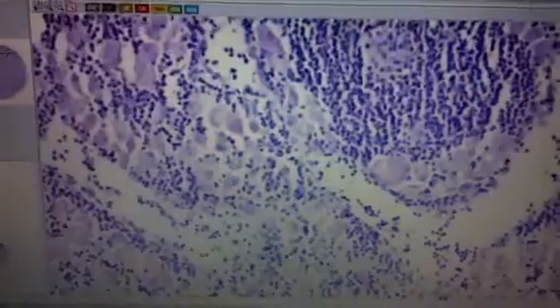This is the gouty tophus, visible in patients with gout. Here you go. You see some needle-like projections. Of course, this always sounds better in books. Reality is a bit harder to see sometimes. But this is what you see. 5 minutes now, need to move faster. Okay.